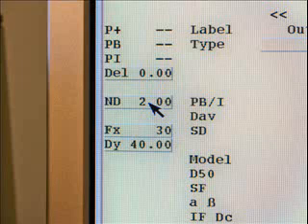After completed calculation, it is convenient to renormalize the dose distribution to a desired level, for example 2 gray per fraction in the tumor.